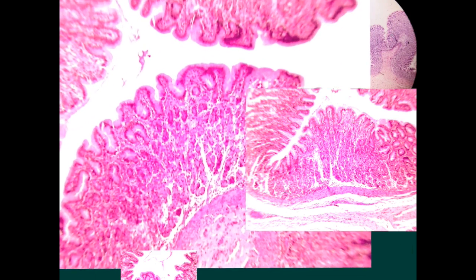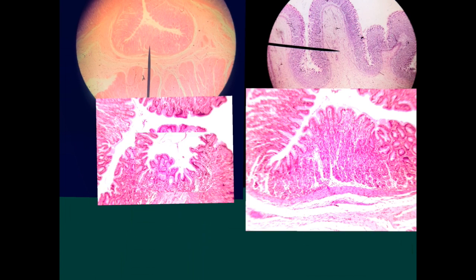Each slide will have the same feature. Also here we have these pits, 1/4 of the thickness. Pits are evident tubes here with a lumen, white lumen, and they are very crowded, and it is a folded mucosa. Again, we have another picture. All the pictures have the same feature. The pits, the crowding, the folding, these are the features of the fundus.